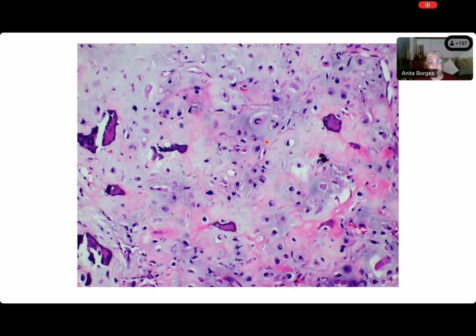You see this at high power. Now, you want to say anything more about these cells, please? Ma'am, there is size and shape variation with each cell. Okay, very good. That's excellent. Yes, there is a size and shape variation of the cell. And what do you mean by the cell when you mention the cell, Sarangi? Size and shape variation of what? The cytoplasm, the nucleus, the shape, what? Nuclear variation. So nuclear. And you don't think that the size and shape of the cell body is varying? Can you see a cell body? Yes, ma'am. Both are, there is variation in both. Yes. So you are seeing cells which have an eosinophilic cytoplasm, wherever you can see them, yes?